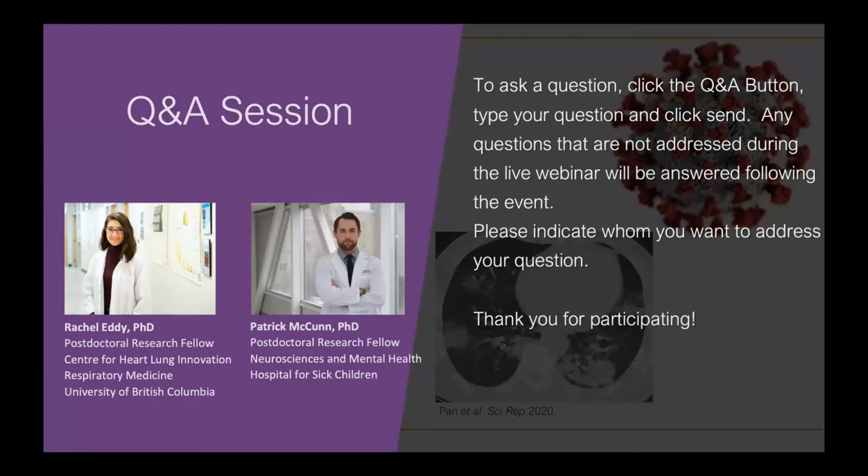Yeah, that's a great question, and obviously one of the biggest limitations to integrating imaging behind those barriers. So the answer is yes. These can all be brought behind the containment facility and integrated into those workflows. Like I briefly touched on, the most surprising one would be having that MRI capability within a BSL3 and 4 containment laboratory.